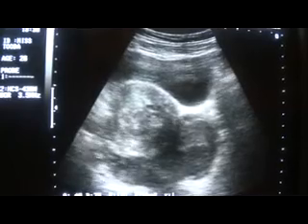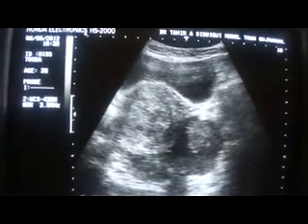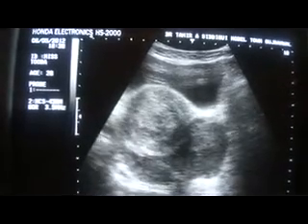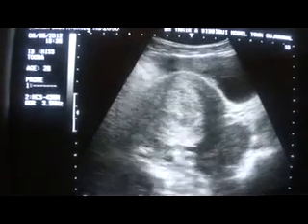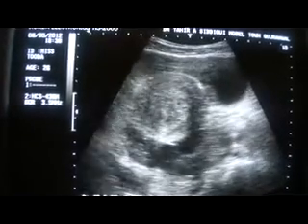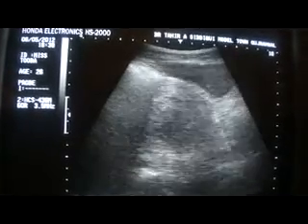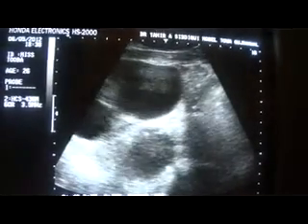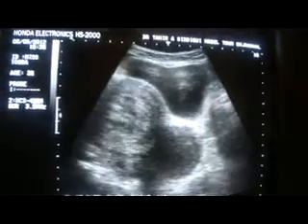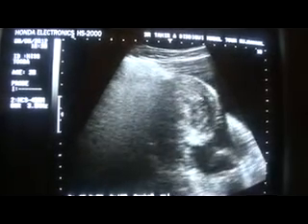Now the second possibility is endometrioma. Third will be endometrial fibroid, because the appearance of the endometrial canal is very much in favor of internal adenomyosis or fibroid, because at the age of 26 years, dysmenorrhea does favor this finding of internal endometriosis.